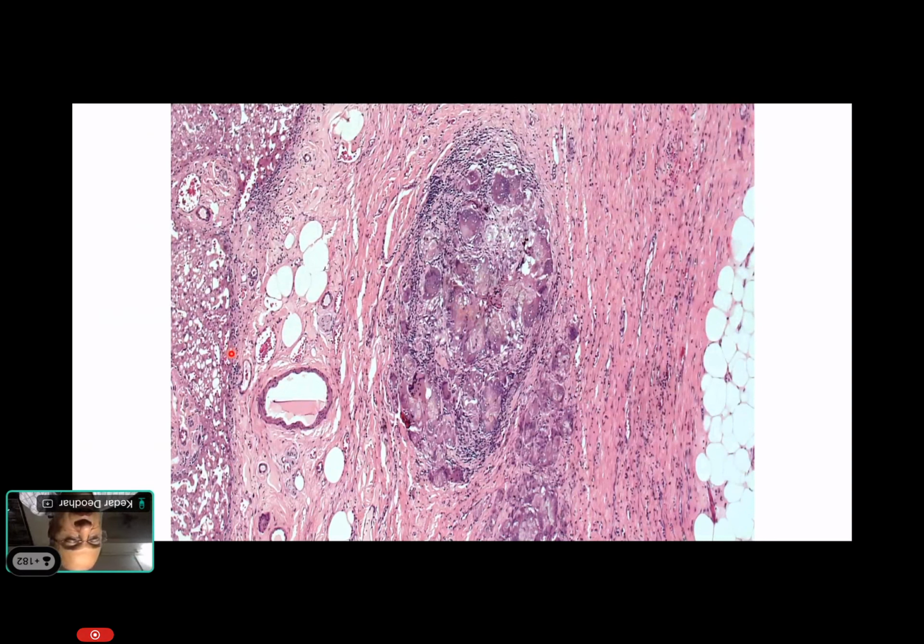Here in this slide, on the right side we have liver parenchyma, which is non-tumorous, and this is an area of the gallbladder fossa. We often see foreign body type giant cell reaction, fibrous reaction, patchy inflammation, cholesterol cleft formation. This is what we commonly see, but we do need to sample this area carefully, or maybe generously, because along with foreign body type giant cells, we may actually see cancer. So that's carcinoma at this place, and that does tell us the staging of the disease.